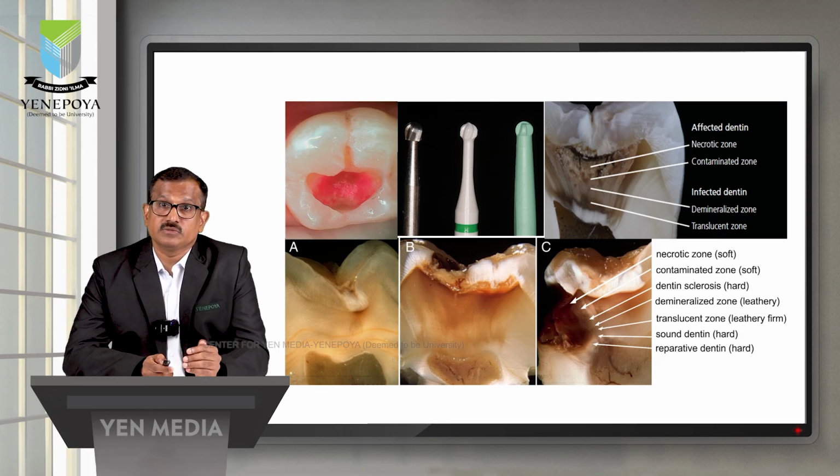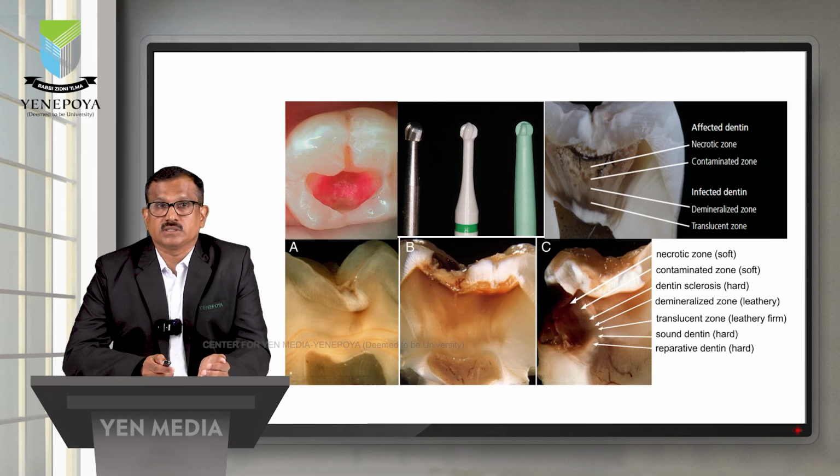if you apply too much force also, it doesn't cut the normal dentine. When there is hard dentine, it doesn't cut that. It matches the softness of the soft dentine, and it stops cutting there. After that, it doesn't cut. We all know that we need a harder material in order to cut. That's why we use diamond point abrasives to take out tooth structure. So here, when the polymer material is used, it is believed that it takes out only what is required.